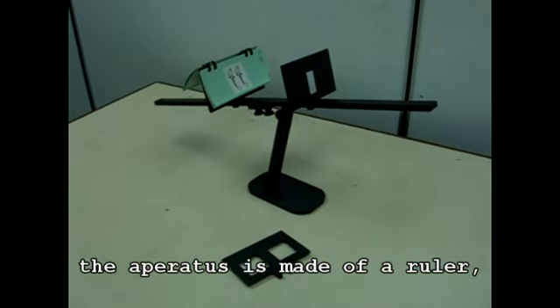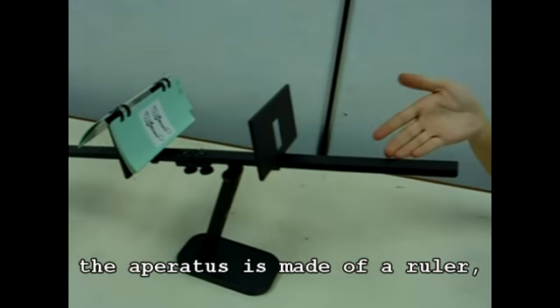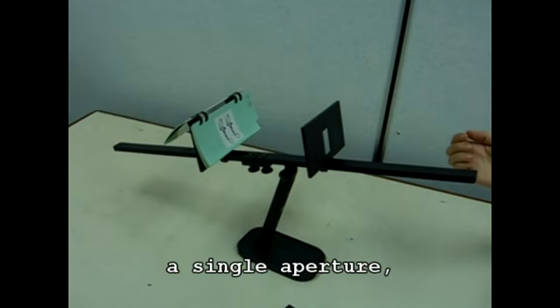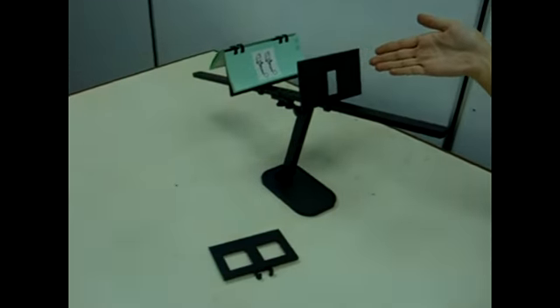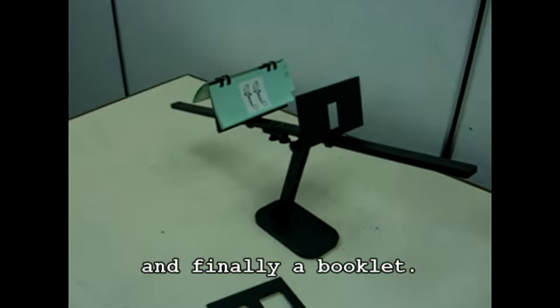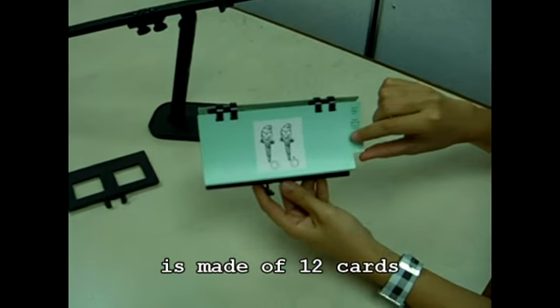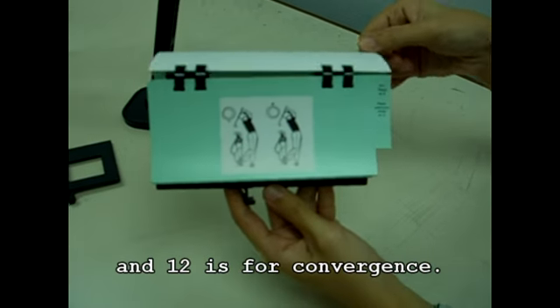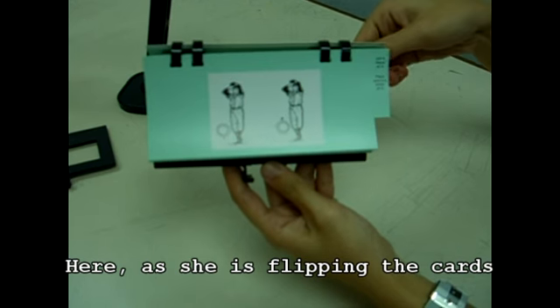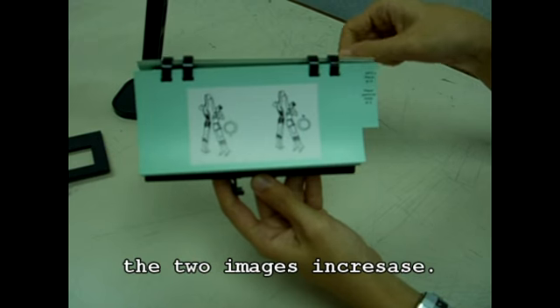As you can see here, the apparatus is made up of a ruler, a stand, a single aperture, a double aperture, and finally a booklet. The booklet is made up of 12 cards, 8 of which are for divergence and 4 for convergence. Here, as she is flipping the cards, the distance between the two images increases.